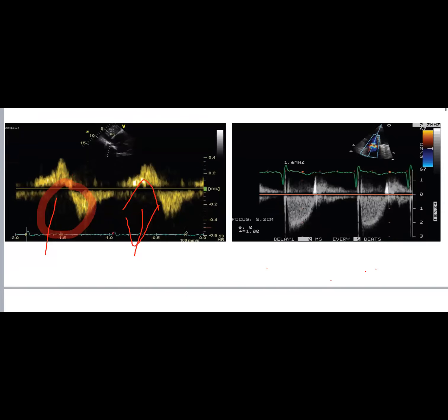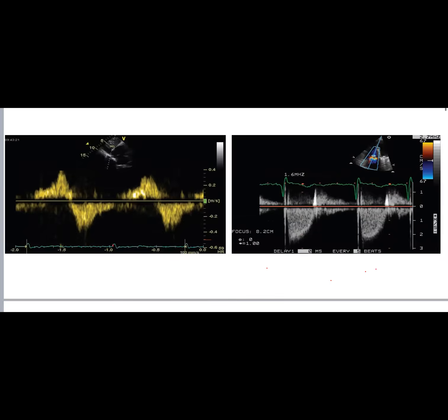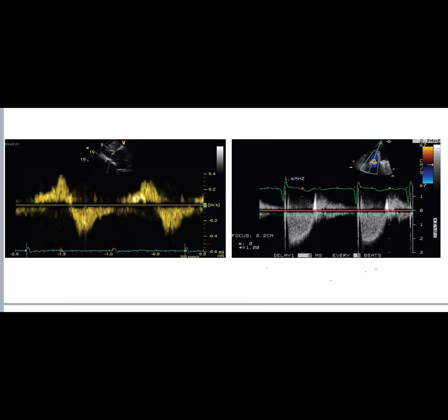Yes. So Dr. Hatim, when we are assessing the PA pressure in conditions in which we have severe TR with a low signal, you are so likely to underestimate the pulmonary artery systolic pressure. And that's why when I have severe TR, I shy away from reporting pulmonary artery systolic pressure. Or at least I will write maybe underestimated, for the same reasons we have discussed.